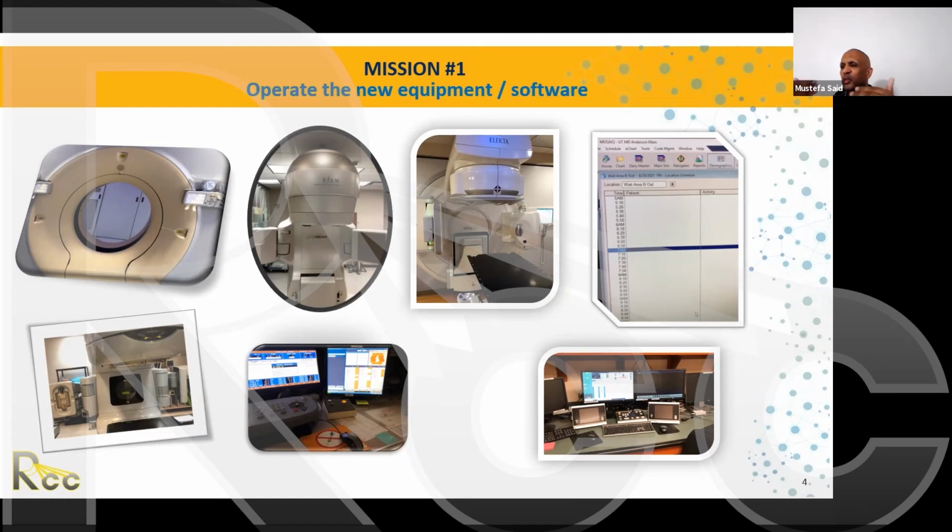Especially those who've been in radiography, the whole thing you learned about dose reduction, keep that in mind, especially when you do kV. One misconception about radiation: when you get to MV, somebody is going to tell you, oh, it doesn't add to the dose, it's just kV. I say to people every time, every photon counts.